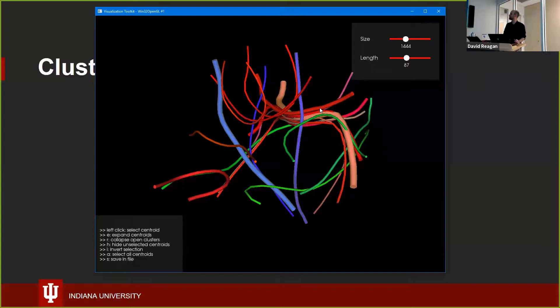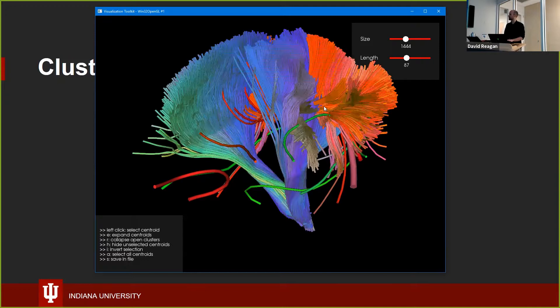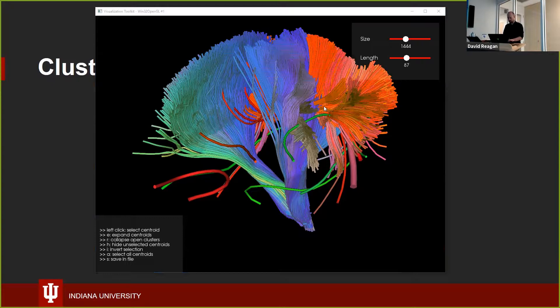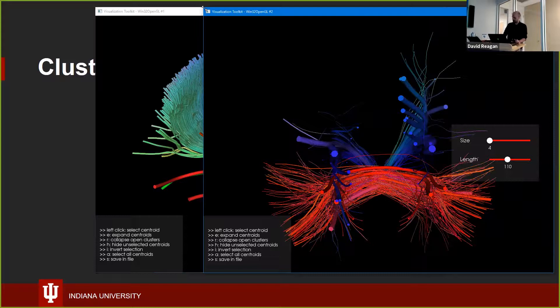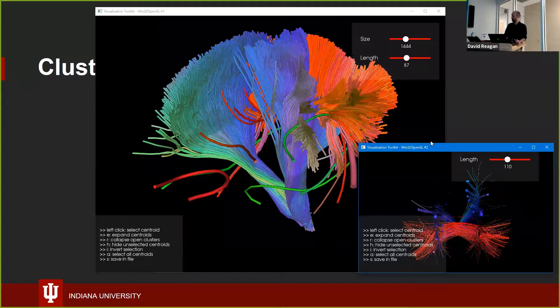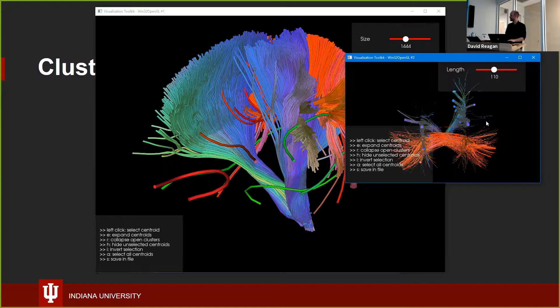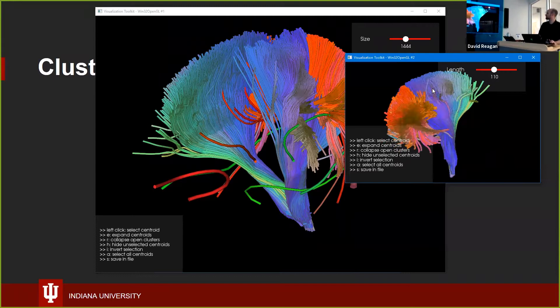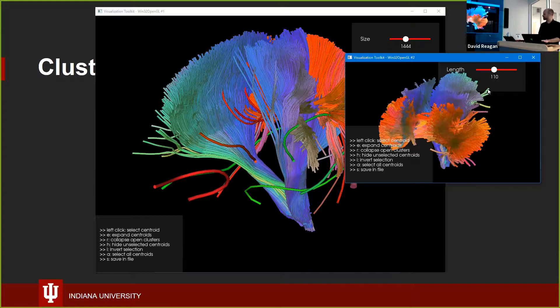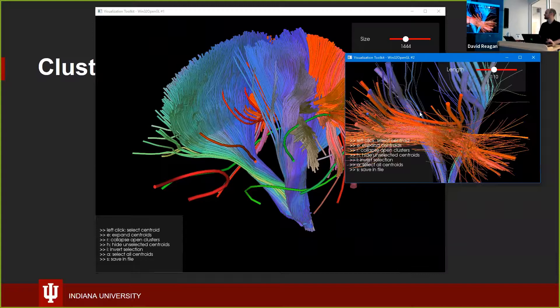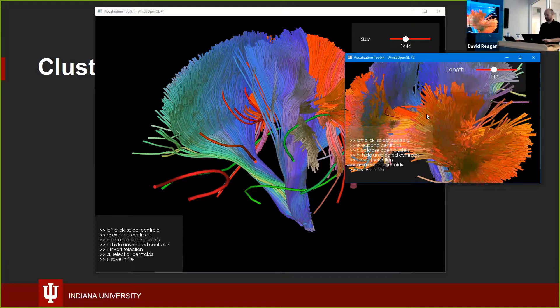I can grab a big one, deselect and expand it, then press another key and it spawns another window — a zoomed-in view of the same cluster. In fact it re-ran the clustering algorithm only on that one centroid I had clicked and expanded. So I can spin it around to get the same orientation, but now I can probe deeper and select even smaller sub-clusters and expand them.